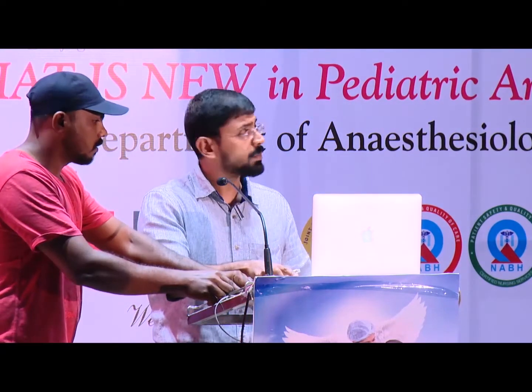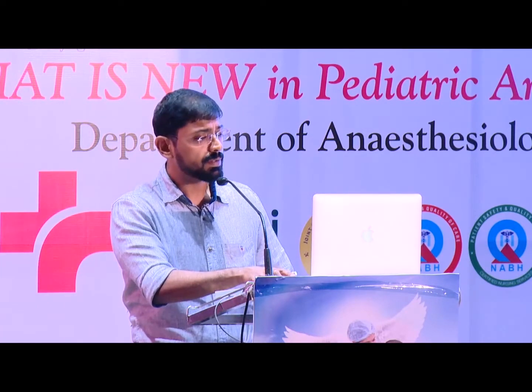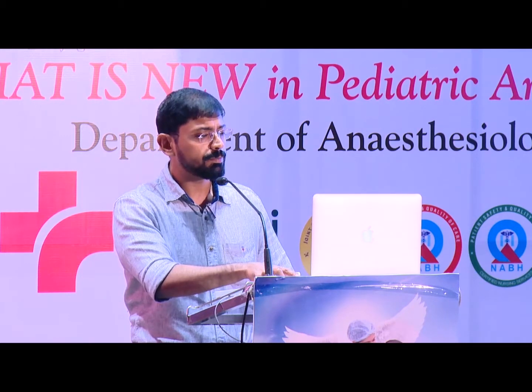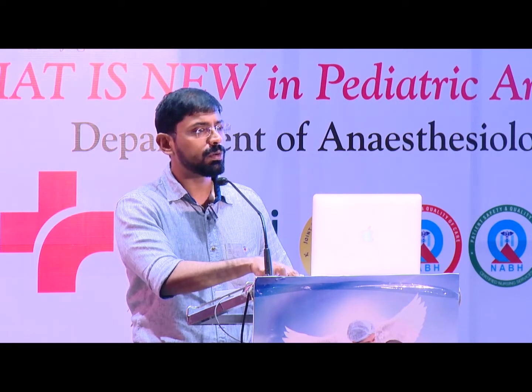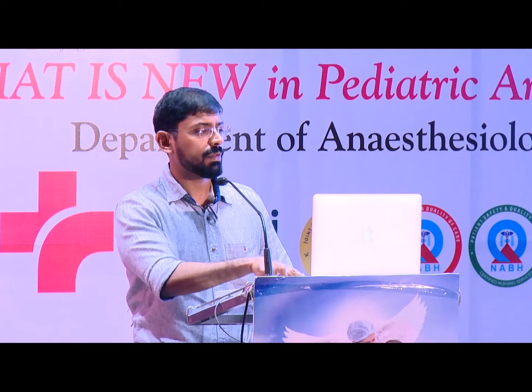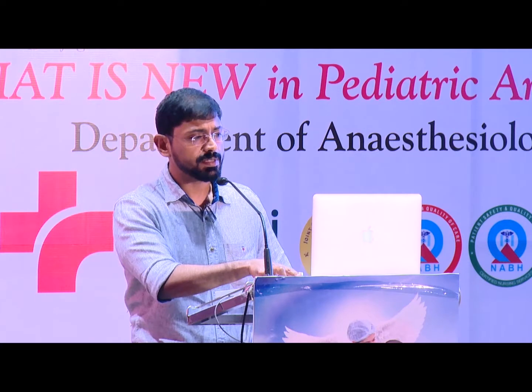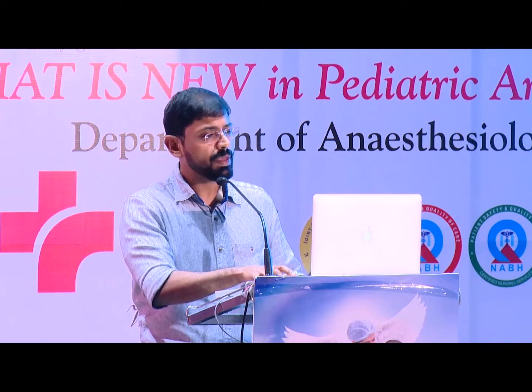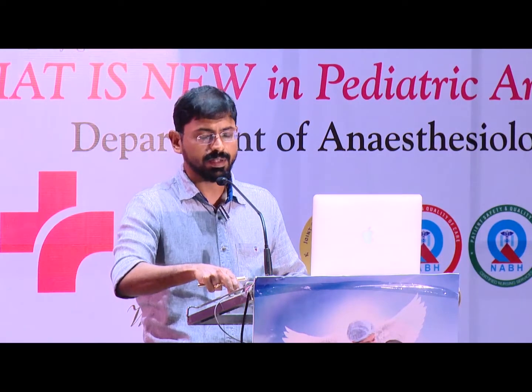He is put on SIMV mode of ventilation. The settings we start with are a rate of 45, a PIP of 16, PEEP of 5, an I time of 0.35 seconds, oxygen of 25%, and a flow of 10 liters. The measured panel settings on the ventilator show the leak to be 0%. The delivered PIP is the same as what we have set. The PEEP is 5, and the tidal volume being delivered is 10 to 12 ml. I think this connection is loose.